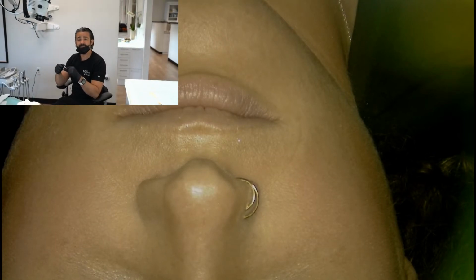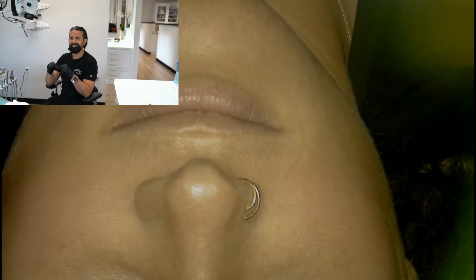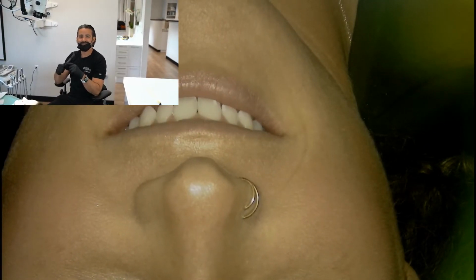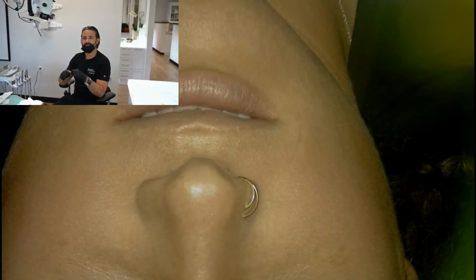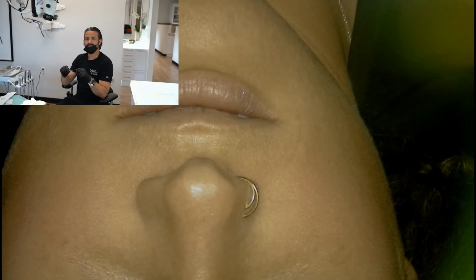Another question? Yeah, question from Lucas. Lucas, what a sweet name. Got a little nephew named Lucas. He's a stud. He says, how useful is using a big LCD for projecting the image from the microscope? I mean, do you use only the projecting image without looking inside the microscope?